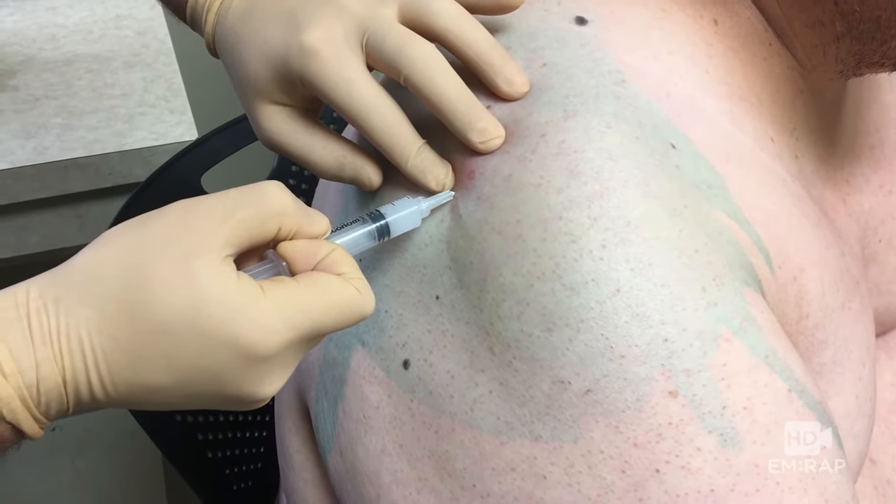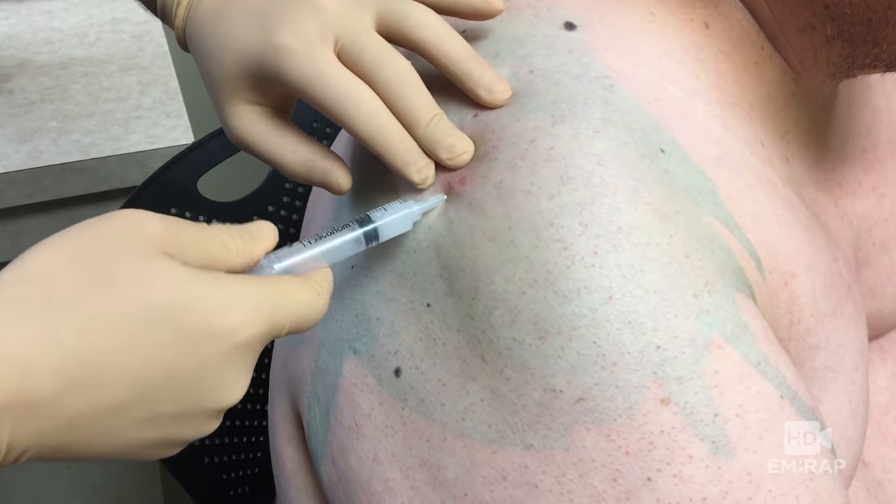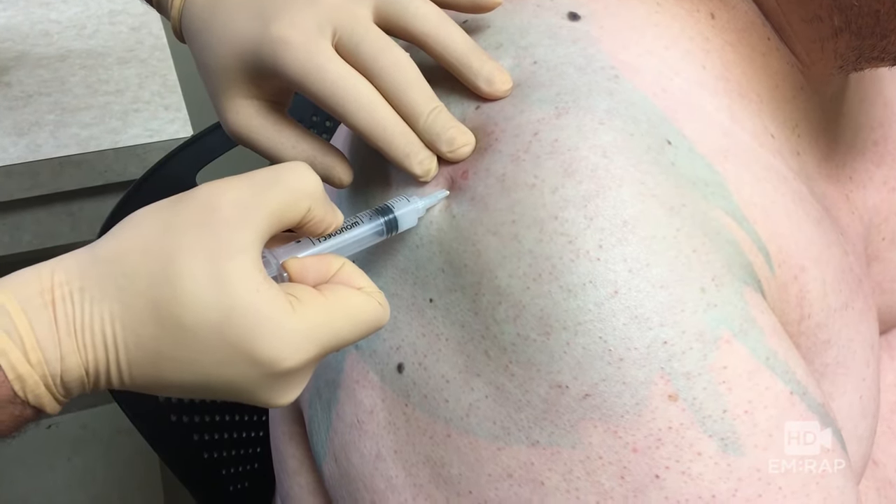If you suspect rupture of a calcific tendonitis, remember to use a larger gauge needle like an 18. That way you can try to aspirate out some of that crunchy calcium deposit first.